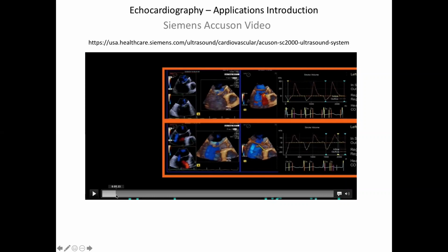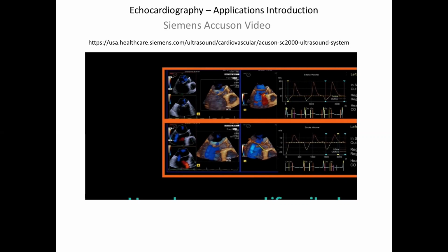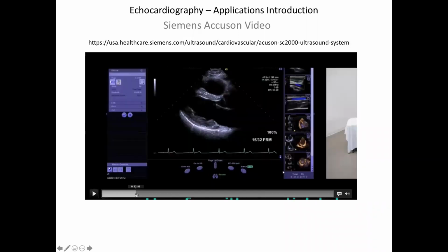And you basically are trying to quantify the severity of the regurgitation, and is it required to put a prosthetic valve in that patient, given that physiology we've measured. So, as imaging scientists, we're all about signal to noise, accuracy of what the data is, et cetera, but then you map it to a number that comes out to say, do I put a new valve in this patient, right? And we'll see that kind of application as we go through some of these things.